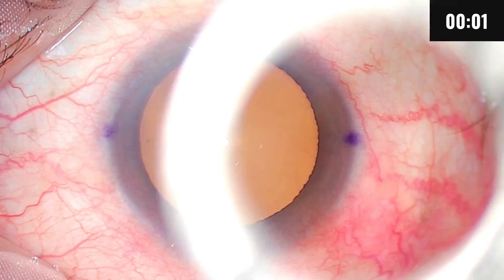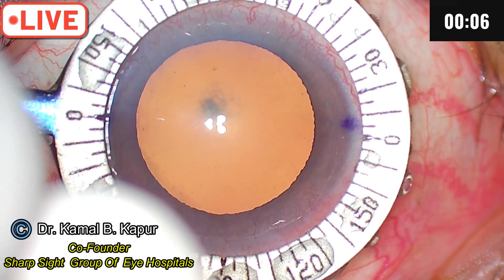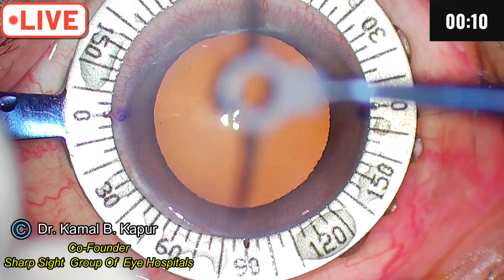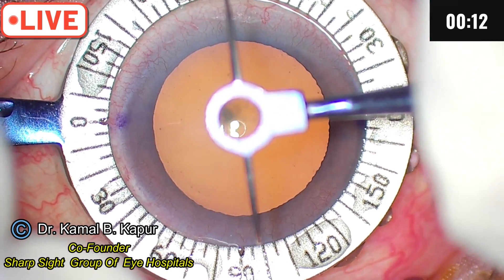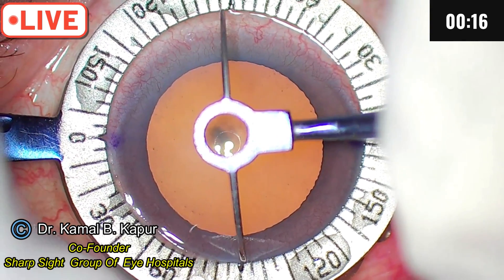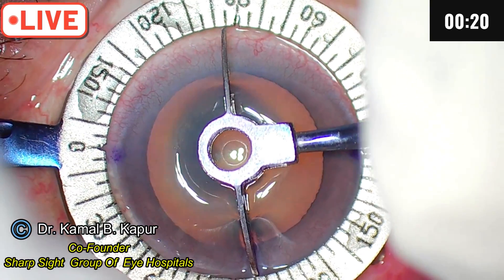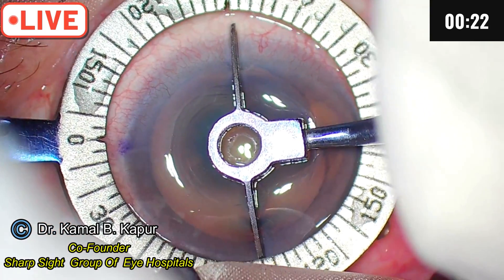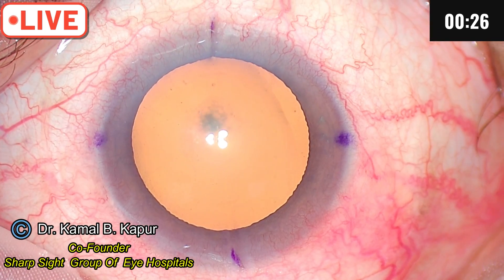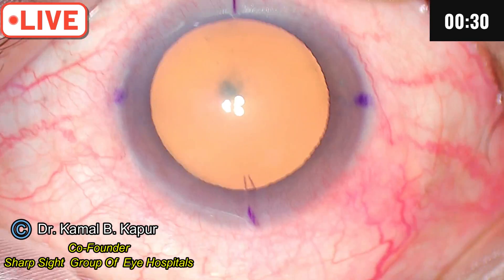This is a case of toric lens implantation. We have the primary marking done on the slit lamp as described. Now we align the marks — we have to mark at 95 degrees. Align the central corneal Purkinje reflex in the center, and there you are — two marks at 95 degrees. Just reinforce those marks.